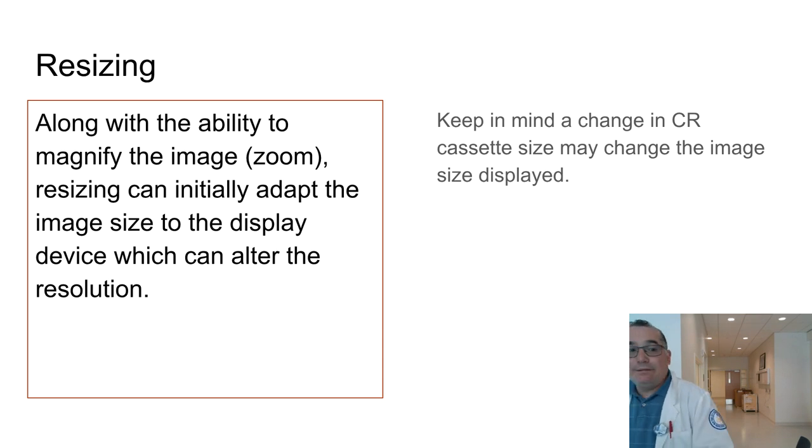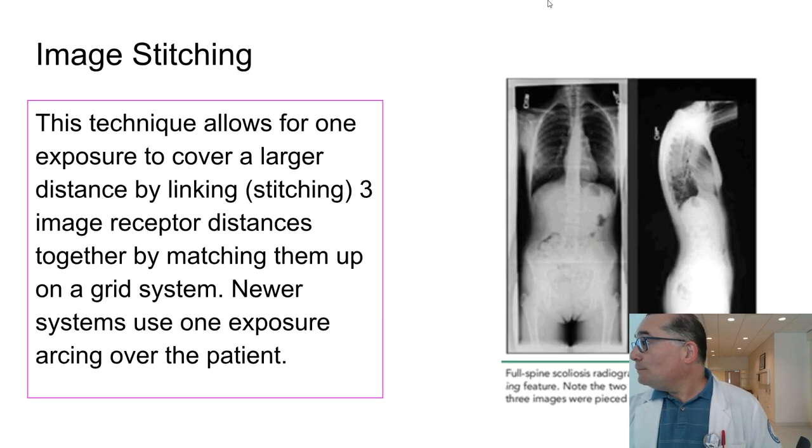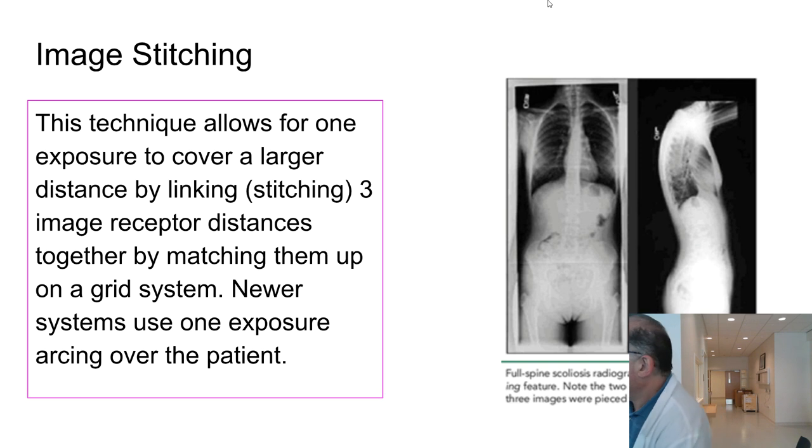So if you DR, you can use the digital set and recollimate, it's not magnified. That's right. If you collimate, in other words, reduce the field size, then that will reduce the amount of magnification. Well, let me say that a different way. If you collimate, it should not get miniaturized.